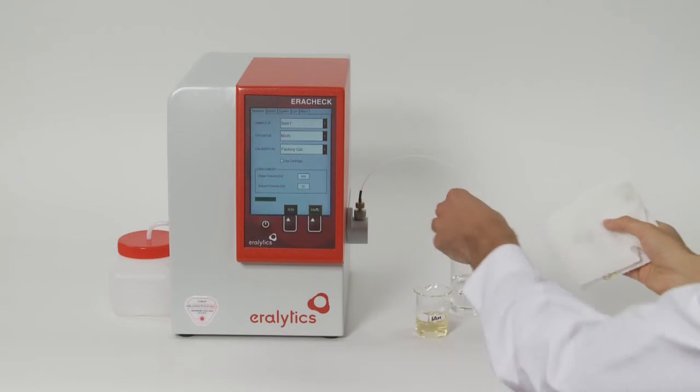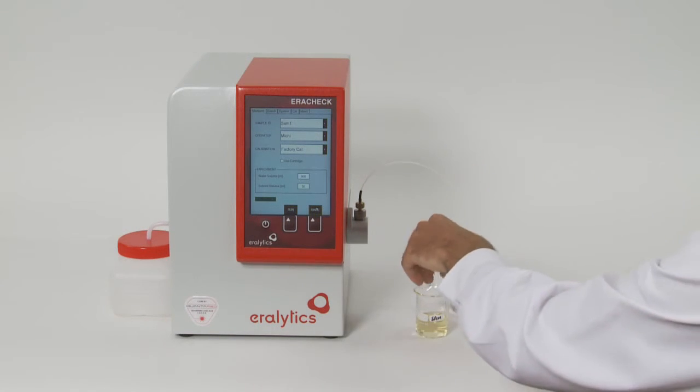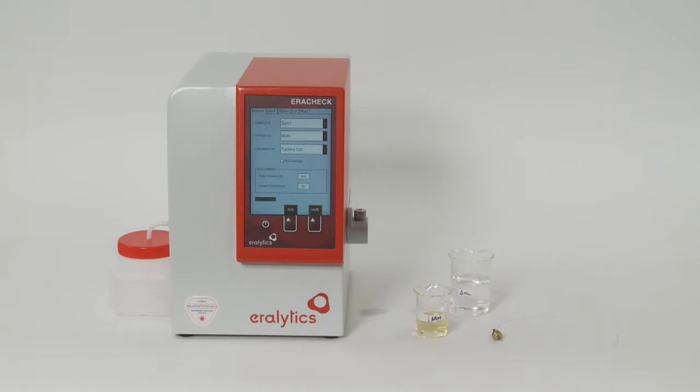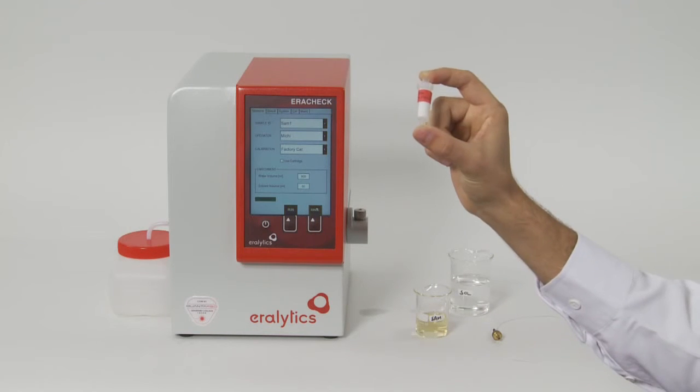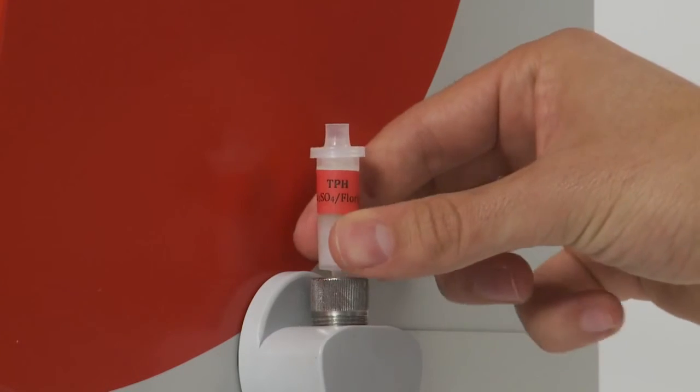If you want to measure total petroleum hydrocarbons in water according to ASTM D7678 instead of oil and grease, both sample and solvent must first be filtered over florisil and sodium sulfate. To simplify this filtration step, a single-use cartridge has been developed that is inserted between the inlet nuts and the inlet tubing.